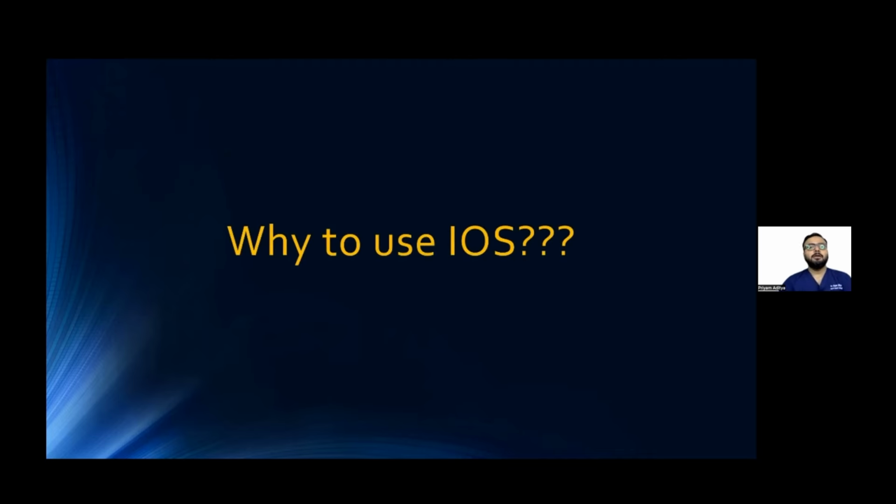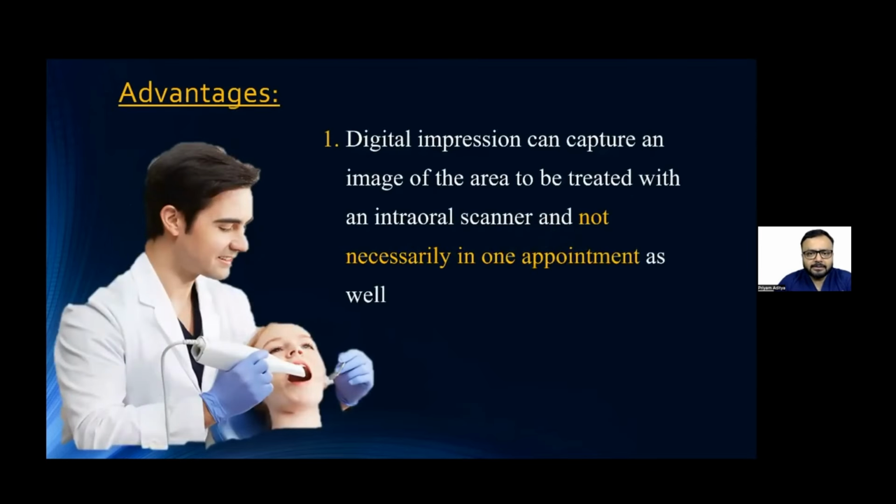So coming back to why use an IOS and not just because of FOMO. The advantage is that now you can make digital impressions which you can record even in multiple appointments, not just in one appointment. So if the patient is very uncomfortable, you can make a lower scan and not do the upper scan, or you can do a part of the scan, and let's say the prep was bleeding, you can stop and then continue the next time. So it is a very convenient way of doing that.